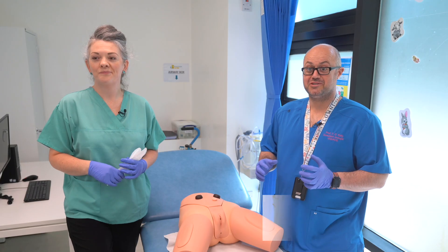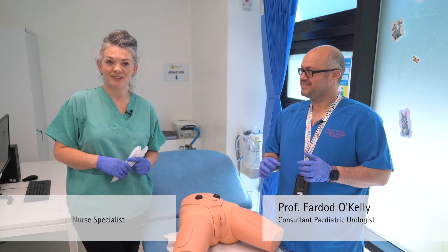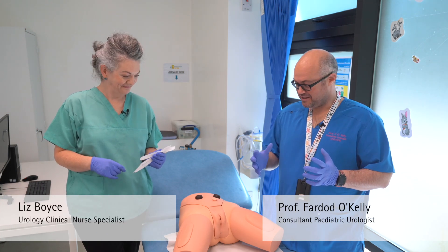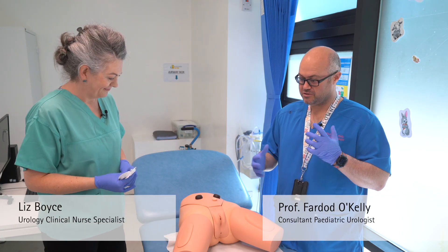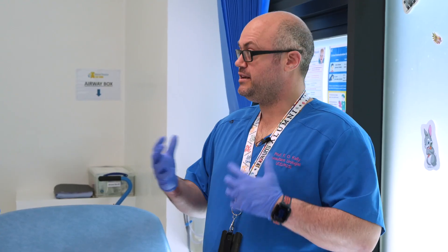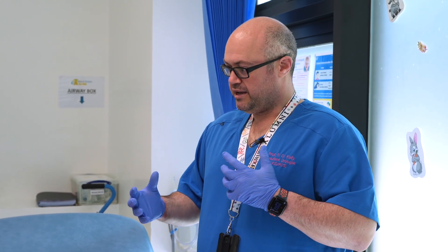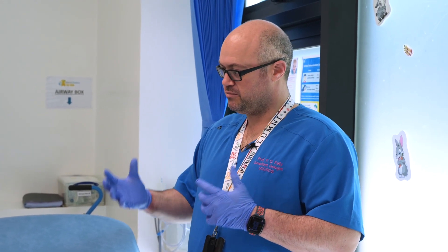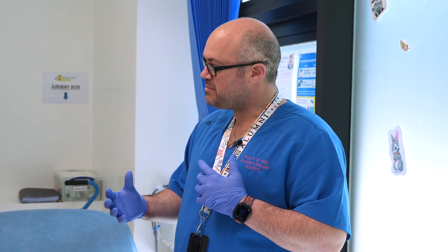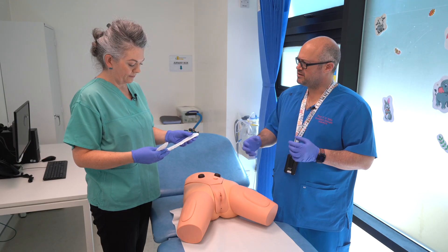My name is Fardod O'Kelly and I'm a consultant urologist, and my name is Liz Boyce and I'm a clinical nurse specialist for urology. We're doing this educational session on clean intermittent catheterization. We looked at one with a male, but we're going to try one with a female specimen now, and there are subtle differences between the two.